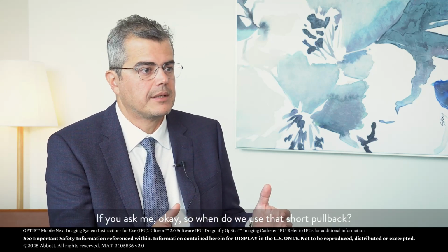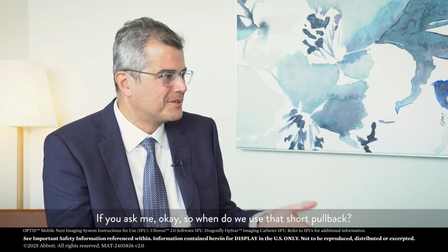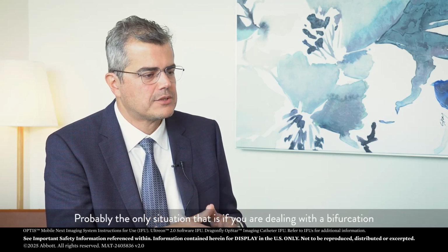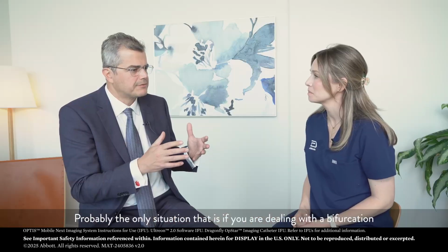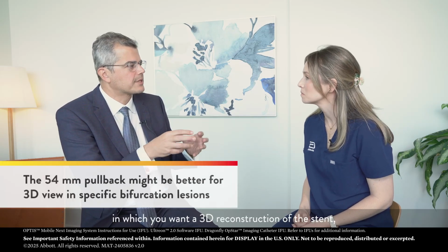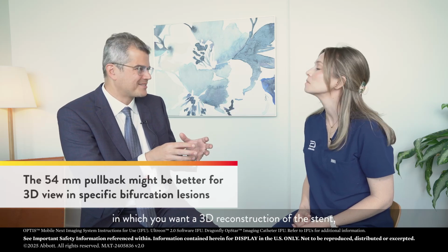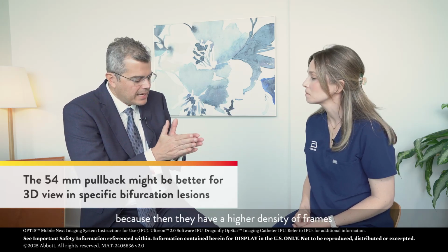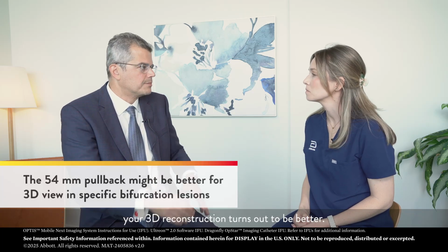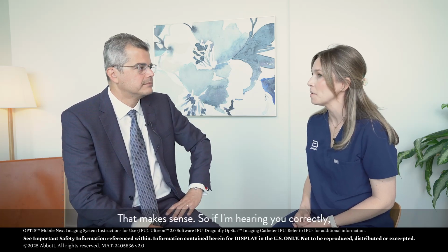If you ask me, okay, so when do we use that short pullback? Probably the only situation is if you are dealing with a bifurcation in which you want a 3D reconstruction of the stent. Because then by having a higher density of frames, your 3D reconstruction turns out to be better. That makes sense.